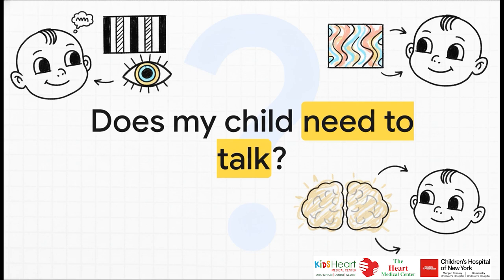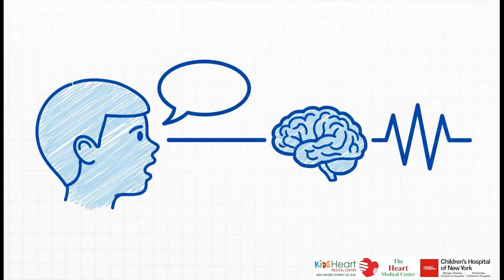Okay, another really critical question, especially for parents with babies or nonverbal kids, is about whether they need to give any kind of feedback during the test. And again, the answer is no. This is actually what makes the test so incredible. It completely bypasses the need for communication. We're not asking your child what they see, we're getting the answers directly from the brain's own automatic electrical response.